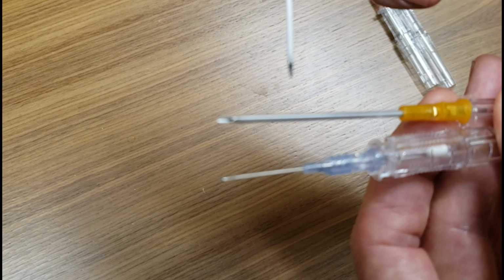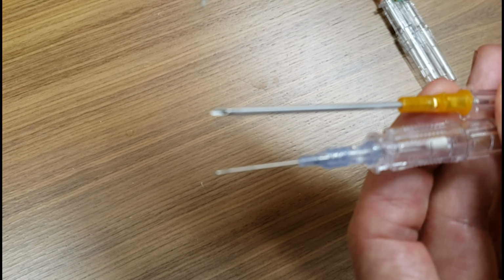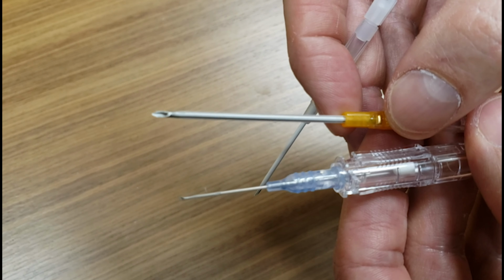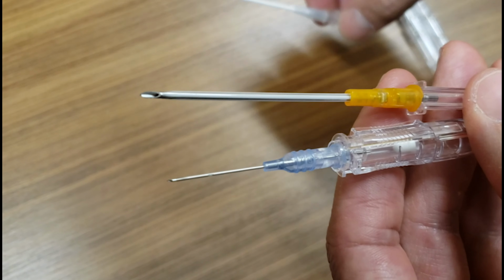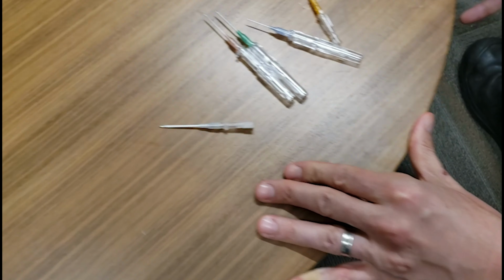When I have a 14 gauge, when I get in 1 millimeter, I get a flash up here, but then I have to know to advance another 4 millimeters, and then I can thread the whole catheter in. So let's now take this over to our model and see what this would look like in terms of the practicality of placing this.